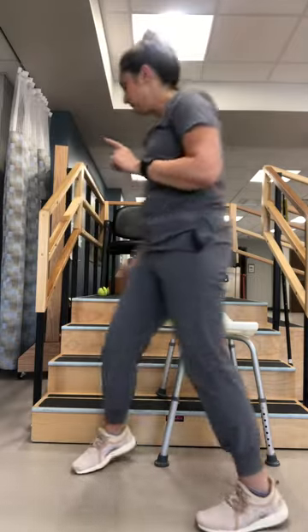Today we're going to address stair navigation. We're going to give you a little trick to make that easier — we're going to use a shower chair.